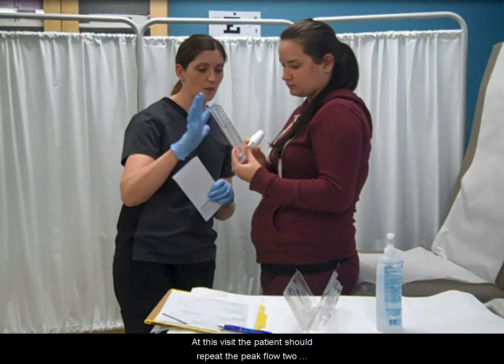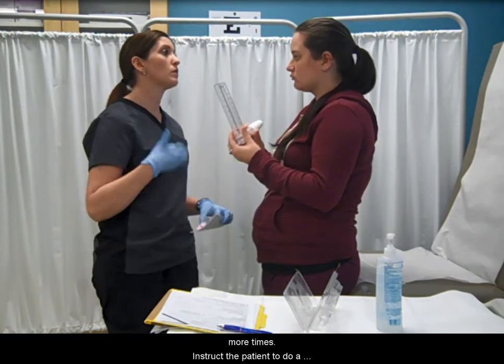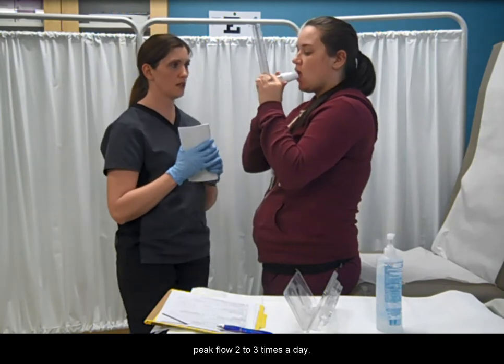At this visit, the patient should repeat the peak flow two more times. Instruct the patient to do a peak flow two to three times a day.